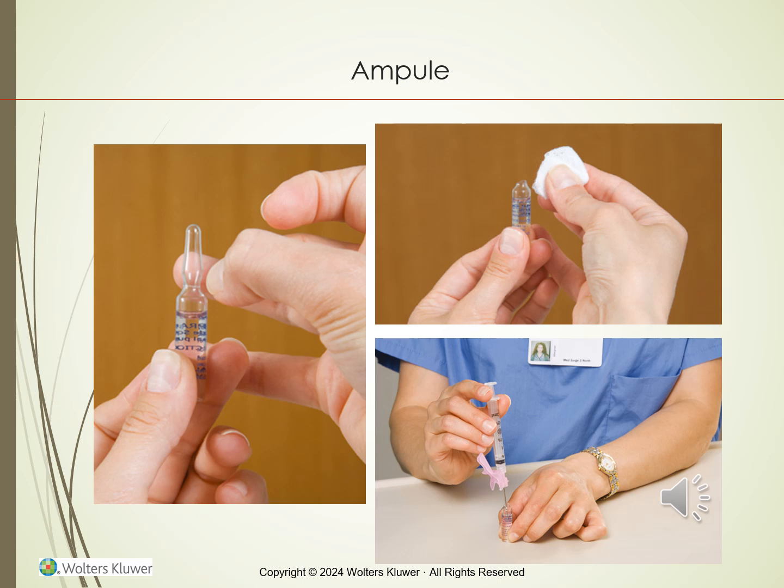One thing to keep in mind is when removing the top, I would use a gauze pad just to prevent anything from getting contaminated and to prevent potential cutting of yourself when removing the glass top.